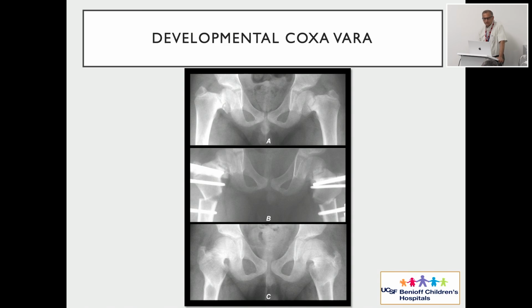You could use this principle for coxa vara as well. Don't look at the implants. You could do the same thing with a blade plate with a medial offset. If your deformity is periphyseal, close to the growth plate of the proximal femur, and you're doing a varus to valgus correction, you have to laterally translate the distal fragment. You don't need an offset when you're doing a varus to valgus correction of a proximal femur; you need to laterally translate. If you're going valgus to varus, then you have to medially translate.